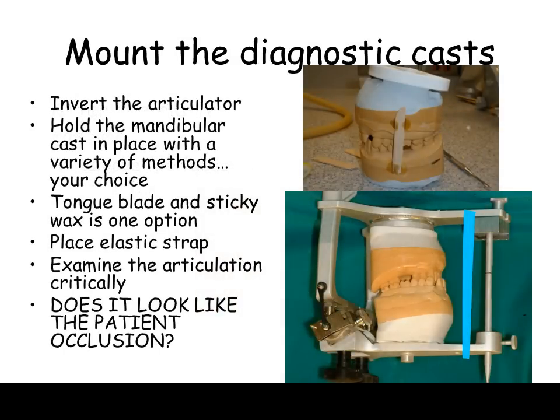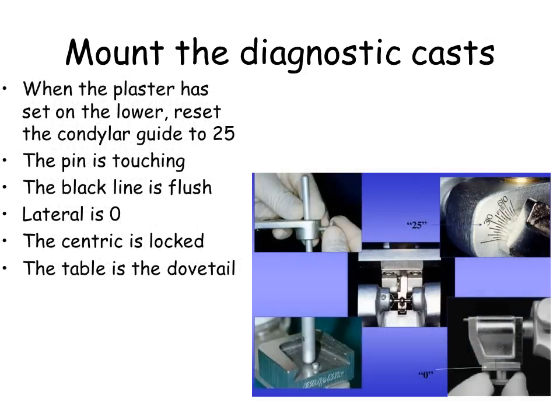Tongue blade and sticky wax is one option. Place elastic strap. Examine the articulation critically — does it look like the patient occlusion? When the plaster has set on the lower, reset the condylar guide to 25. The pin is touching. The black line is flush. Lateral is zero. The centric is locked. The table is the metal dovetail.